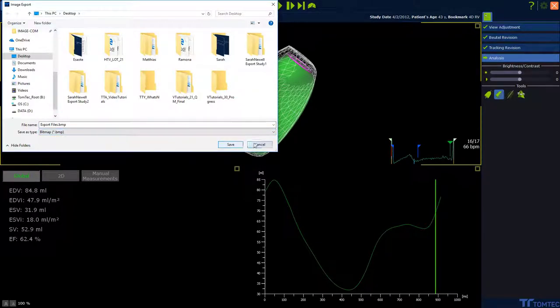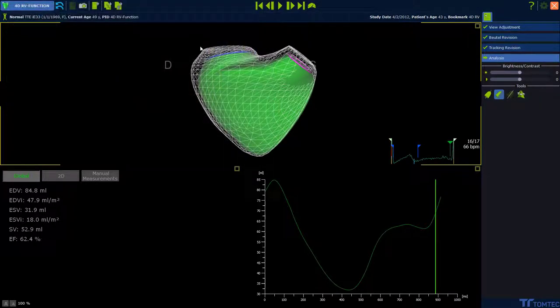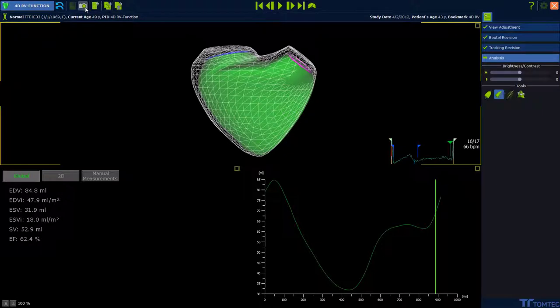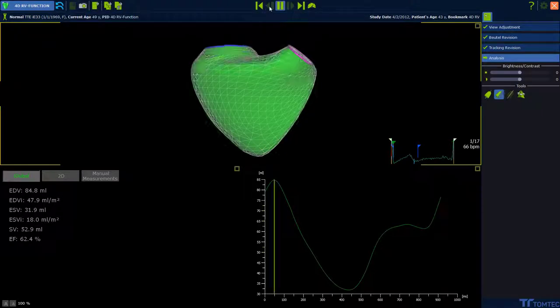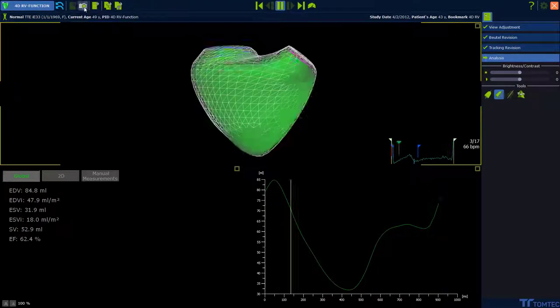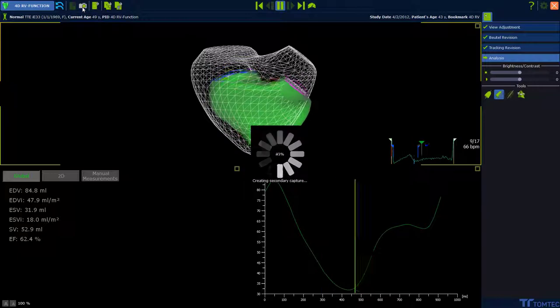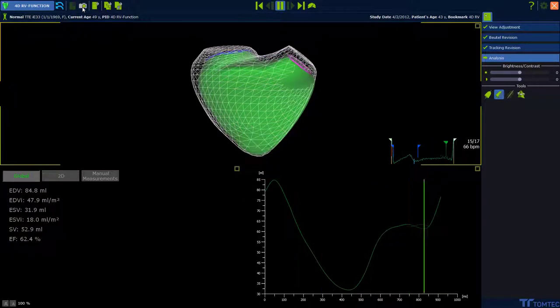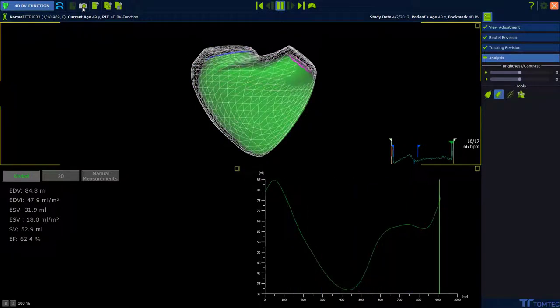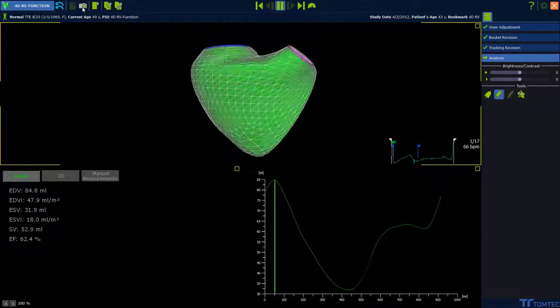Secondary capture is now the same like an image com. If you click on the secondary capture icon, we are producing a new DICOM file which is added to the end of the study.